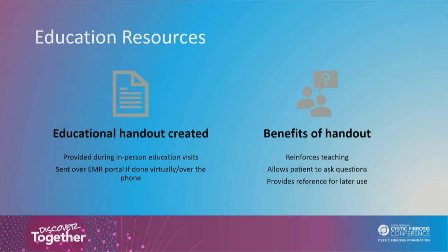An educational handout was also created. The handout is provided during in-person visits, or we send it via the patient portal for virtual or phone visits. We feel this handout reinforces the education and allows the patient to ask questions, and it will also become a reference for later use.